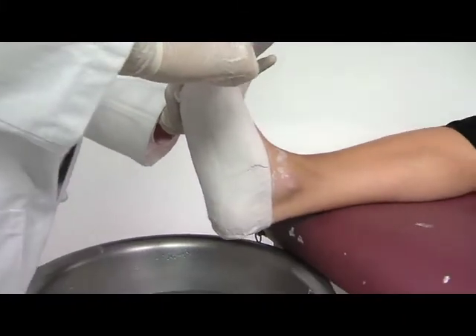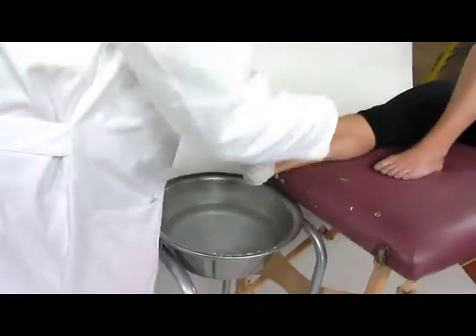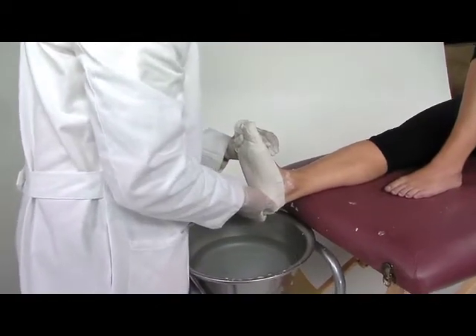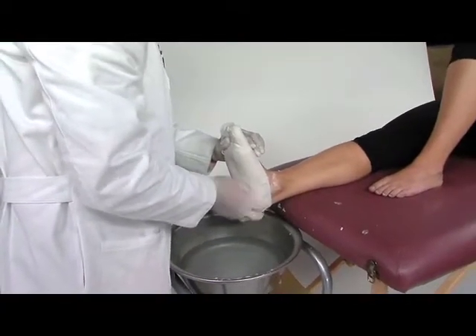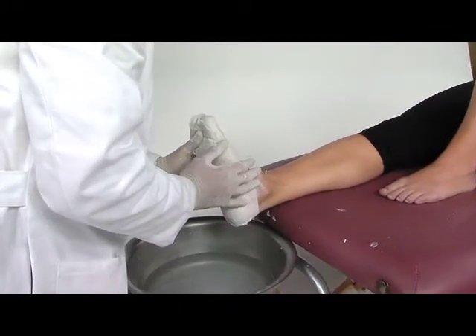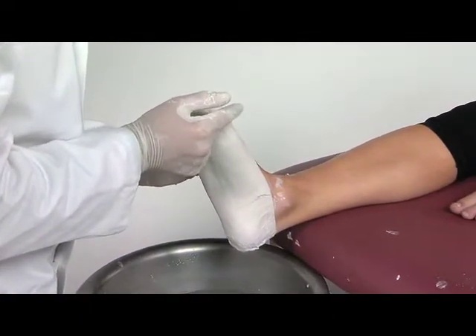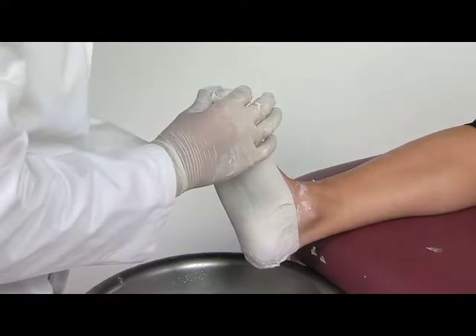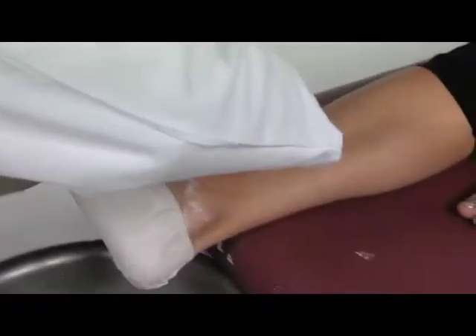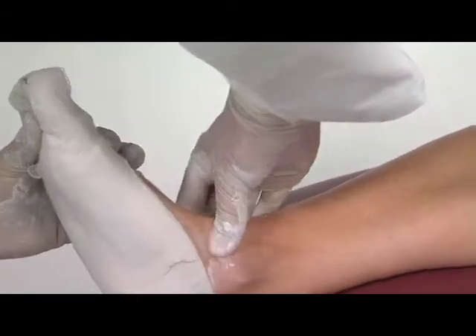As you're casting, I like to push my body right into the position, which makes it a little bit easier to cast and hold this until I can hear that the cast is hard and ready to be removed. Typically, when the last splint makes that tapping noise I know it's ready to go. Then take the skin on the top and pull the skin loose to separate your skin from the plaster.